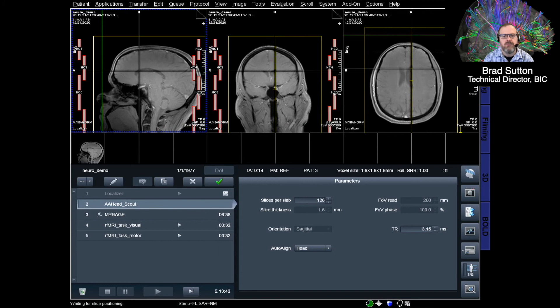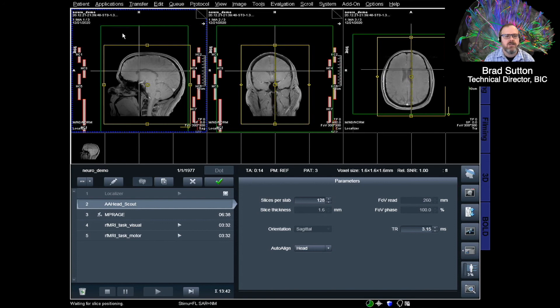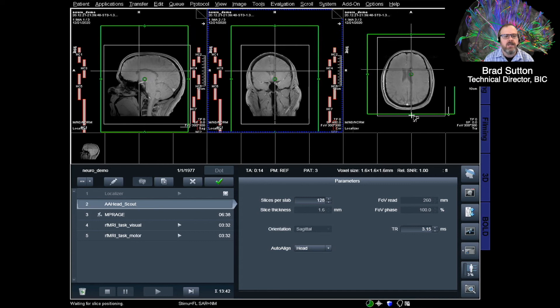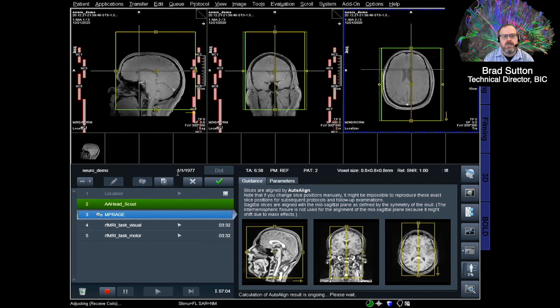You can see the three views here — side view, front view, and top-down view across the display. The gray boxes at the edge are the coils placed around the head, sensitive to different parts of the brain. We're now setting up where the next scan should be acquired for better localization. This next scan does a quick 3D scan of the whole head to help automatically align things for follow-up scans.